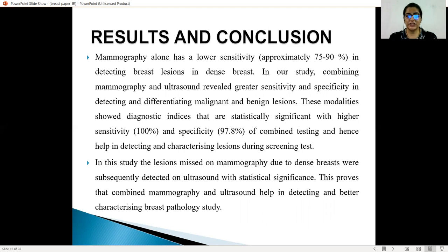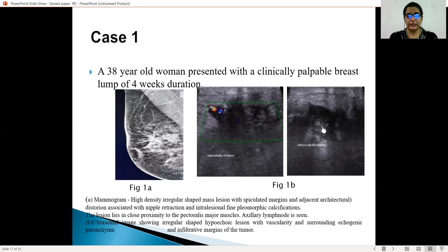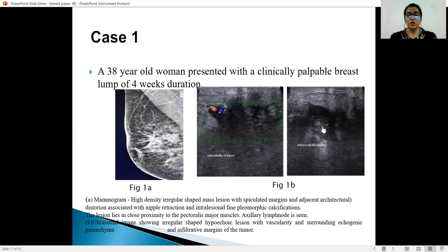In this study, lesions detected on mammography were subsequently confirmed on ultrasound with statistical significance. Combined mammography and ultrasound helps in detecting and better characterizing breast pathologies, including small lesions and premalignant conditions like atypical ductal hyperplasia. The most common type of cancer on histopathology was invasive ductal carcinoma. Case 1: a 38-year-old female with a clinically palpable breast lump for 4 weeks. The mammogram shows a high-density, irregular-shaped mass with spiculated margins, architectural distortion, nipple retraction, and fine pleomorphic calcifications. The lesion was in close proximity with the pectoral muscle, and axillary lymphadenopathy was noted. The ultrasound shows an irregular-shaped hypoechoic lesion with vascularity, surrounding echogenic parenchyma, and infiltrating margins.